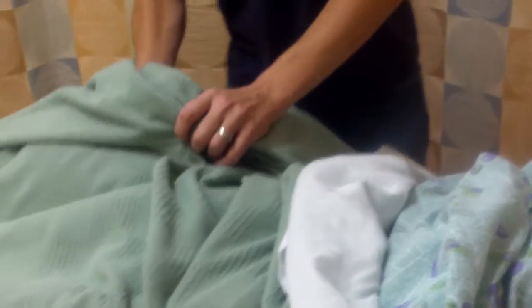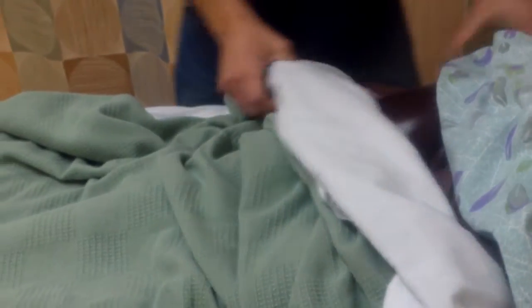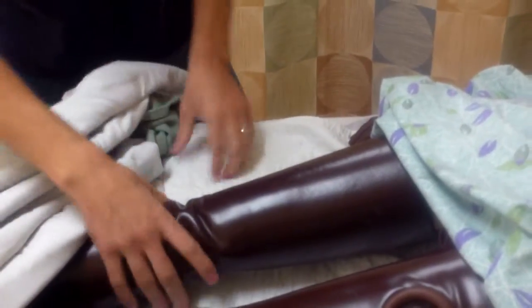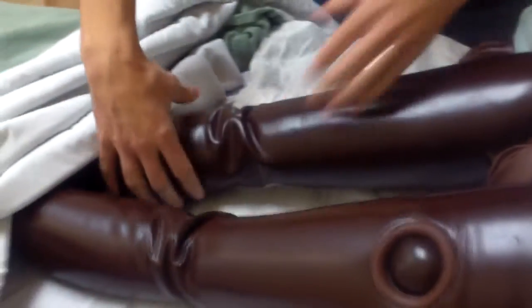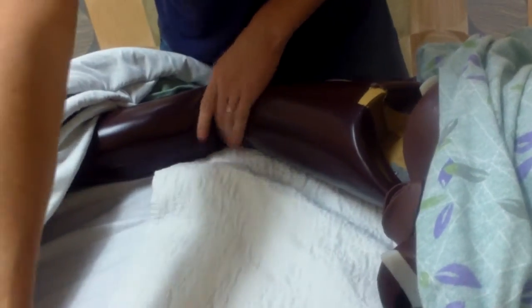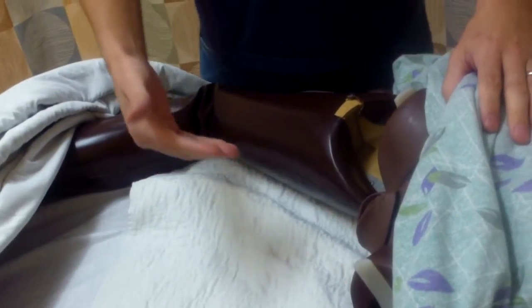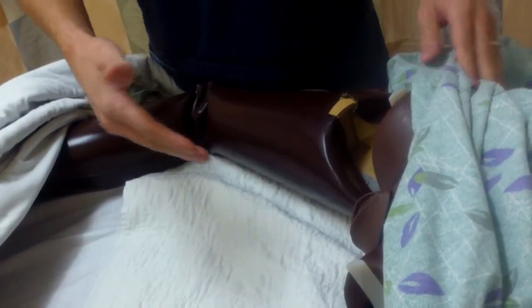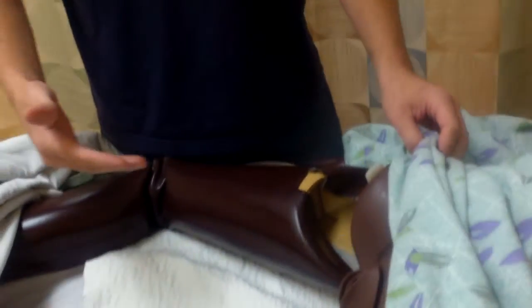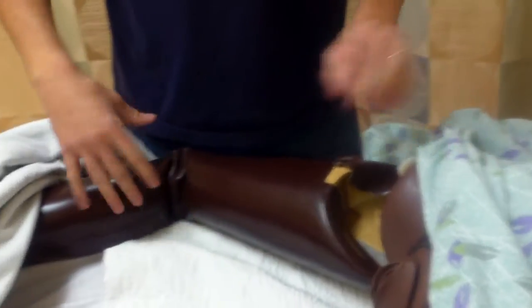So this pillow. Okay. So then I would... okay. So at this time I would do some pericare, and I would also do the pericare front to back, clean to dirty, and I would also try to note the location of the meatus to help me out with the insertion of the Foley catheter.